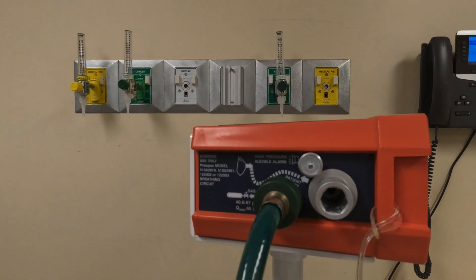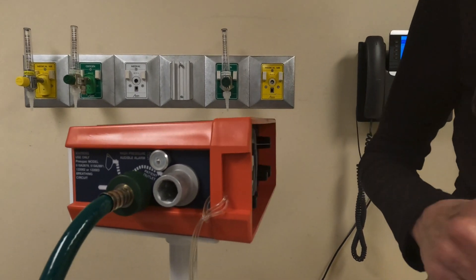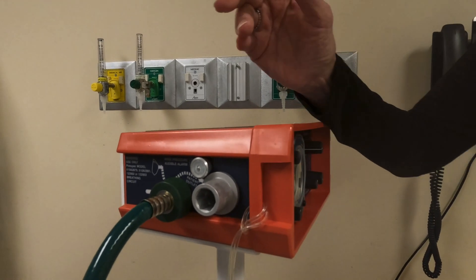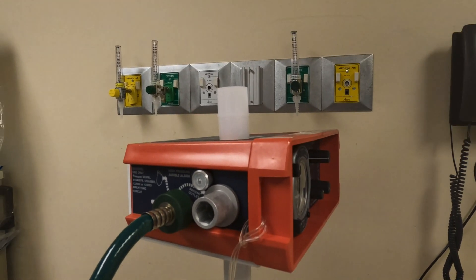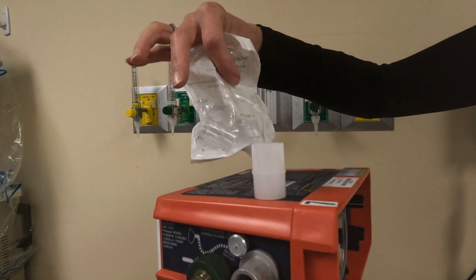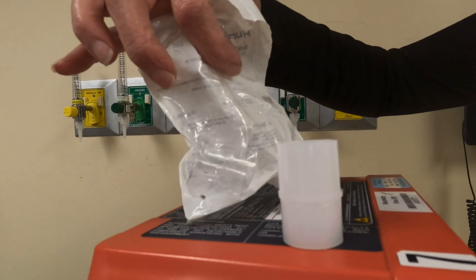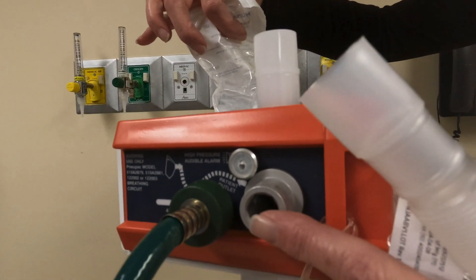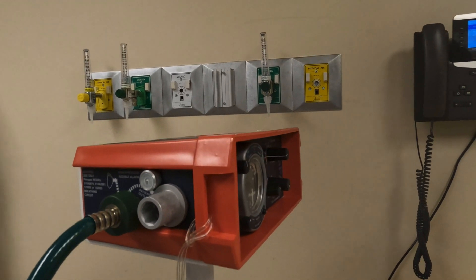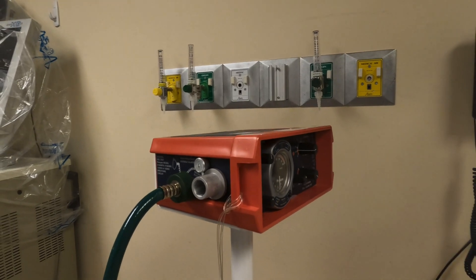In the event you end up with one of the circuits that does not click right onto the filter so the filter can sit flush, we use one of our larger adapters with a 15 by 22. This will attach to the bacteria filter, which will then go on to the port right here. For time constraint purposes today, we're just going to pop it right on there.